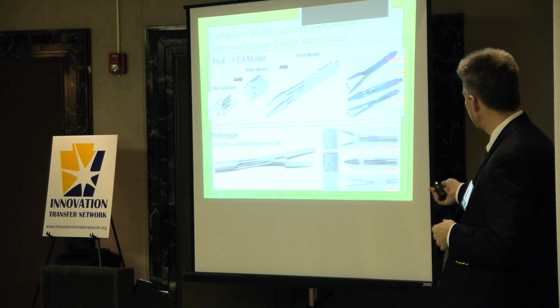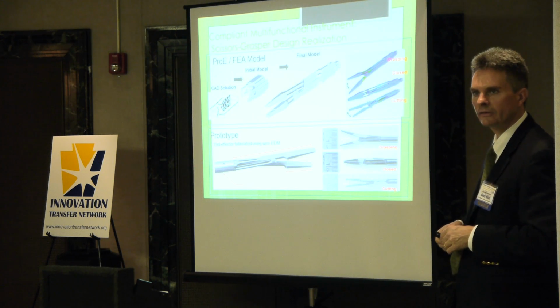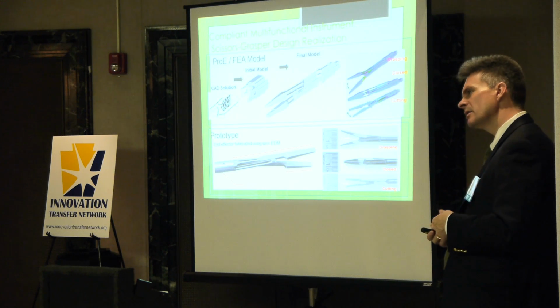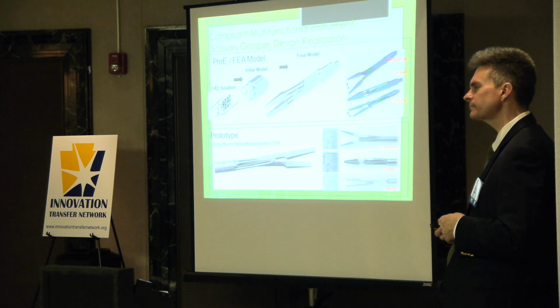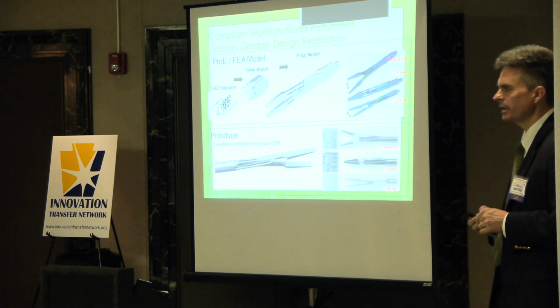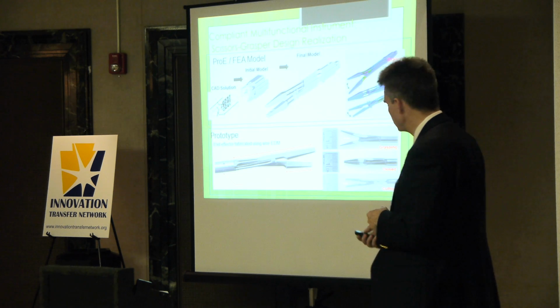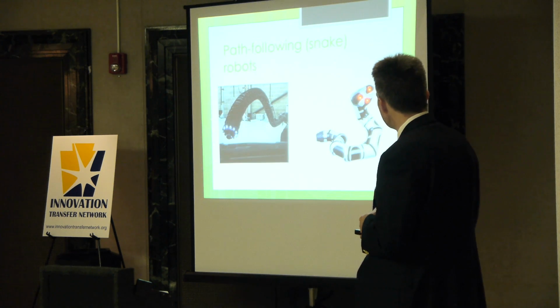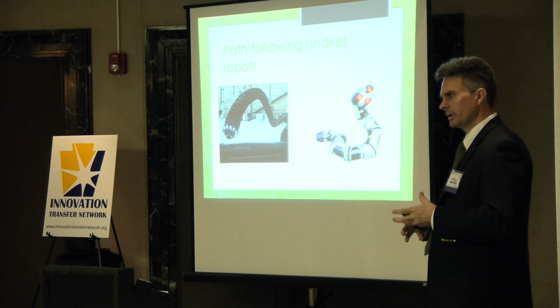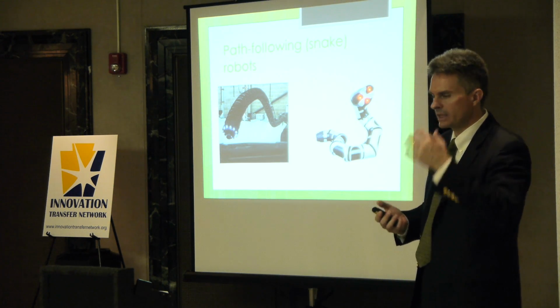And we manufactured these things, and we did a whole lot of engineering type testing on them, and we worked with Alcon on this, we worked with Specialty Blades in Stanton, Virginia. Unfortunately, we haven't gotten these to market, but we'll keep working on it. This is something we've done within our surgery innovation group within the medical center, and this is this extended reach or dexterity.